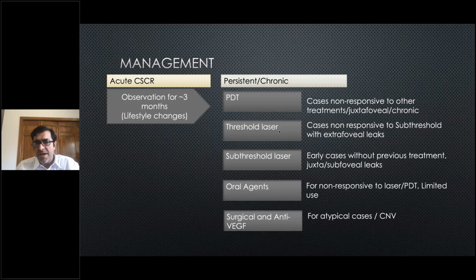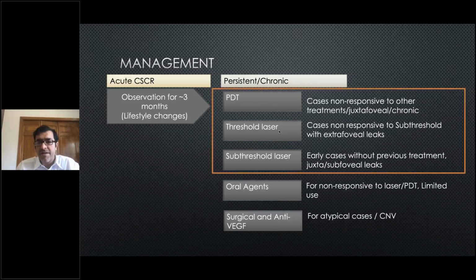So how do we actually manage persistent or chronic CSCR? There are various options, as you can see, ranging from laser therapies to oral treatment and surgical or anti-VEGF. But for today's discussion, we are going to focus only on the laser treatments.